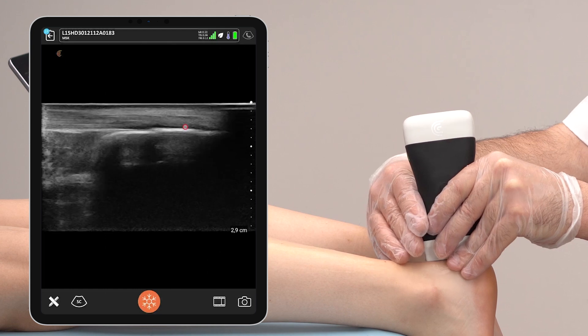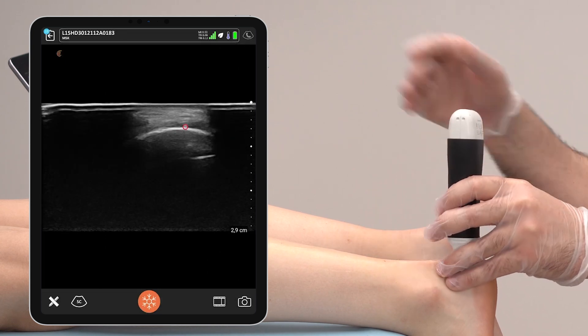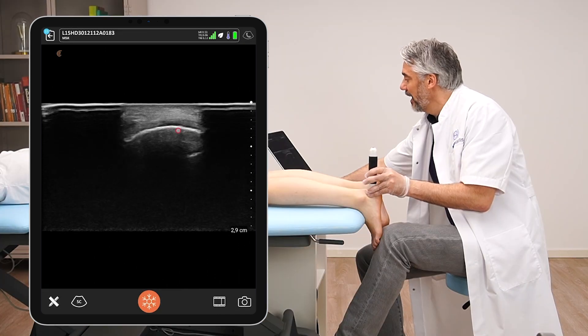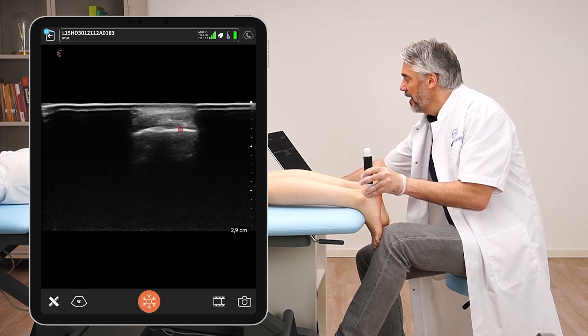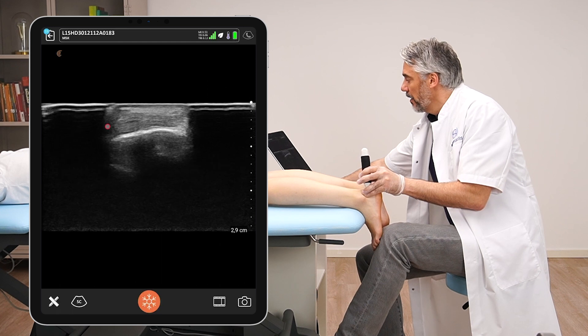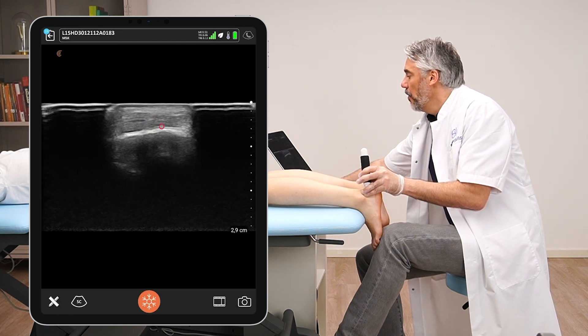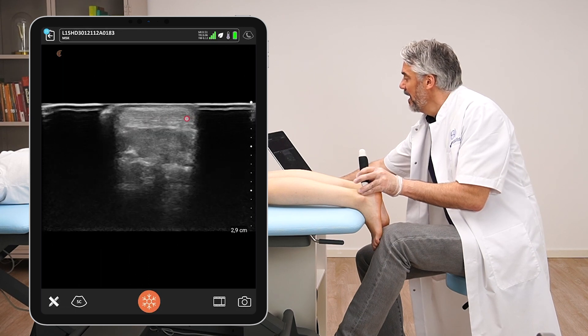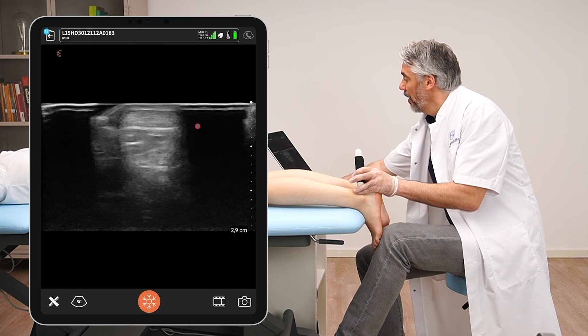Moving the transducer to a short axis view, we can see the Achilles tendon in cross-section. First scanning over the calcaneal bone, we can see the Achilles tendon on top of it — on either side there will be air artifact which cannot be avoided. Make sure you have a nice oval appearance of the Achilles tendon on screen. In this transverse view, assess the echogenicity and thickness of the tendon, and also the cross-sectional area, then follow the tendon towards proximal.